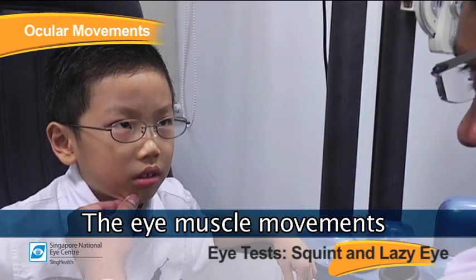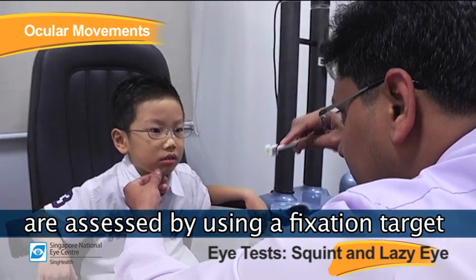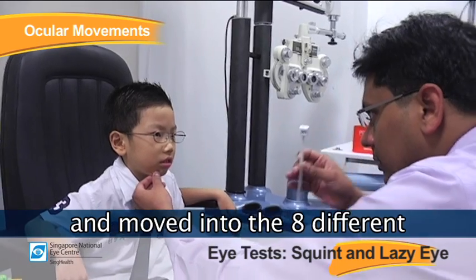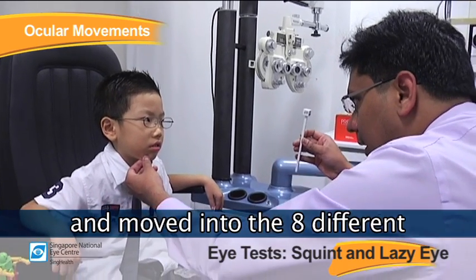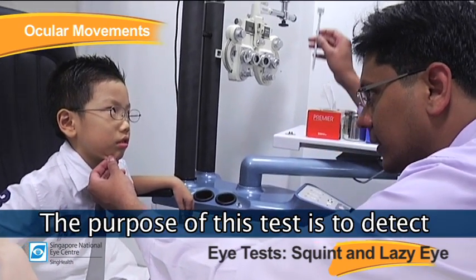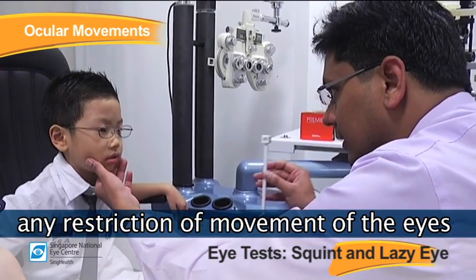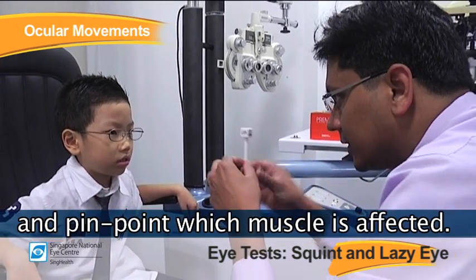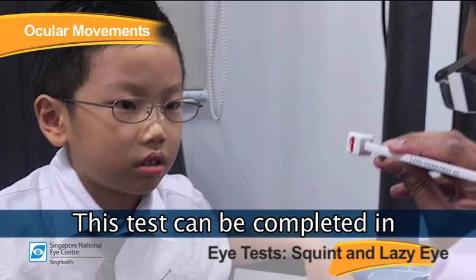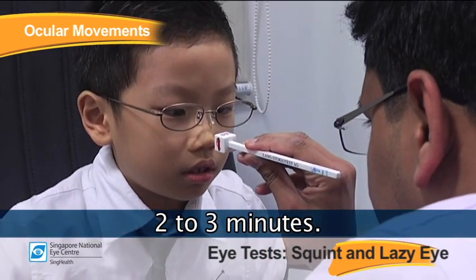Eye muscle movements are assessed by using a fixation target held in front of the patient and moved into 8 different eye positions. The purpose of this test is to detect any restriction of movement of the eyes and to pinpoint which muscle is affected. This test can be completed in 2 to 3 minutes.